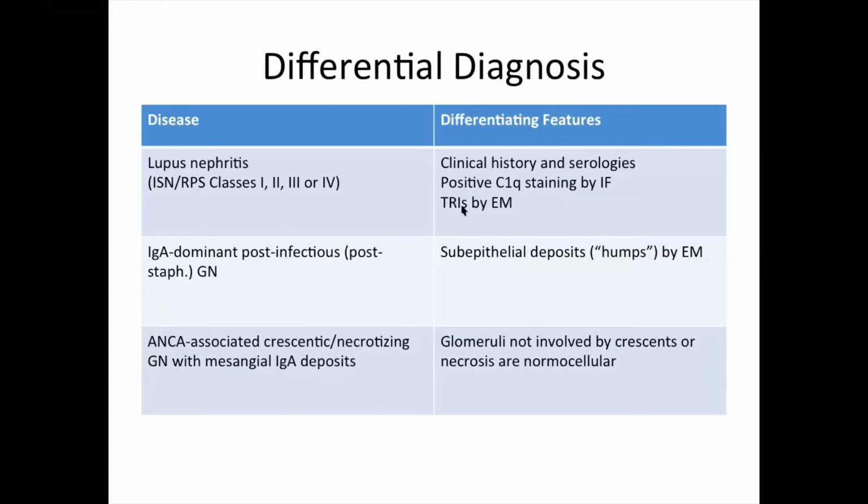So sometimes the IgA can be, for example, 2 plus; there were cases in which the IgA on the IF is 2 plus. Something else I need to tell you is that sometimes in IgA the IF can be segmental, only affecting part of the glomerulus, and it can be focal, involving some of the glomeruli but not all of the glomeruli.